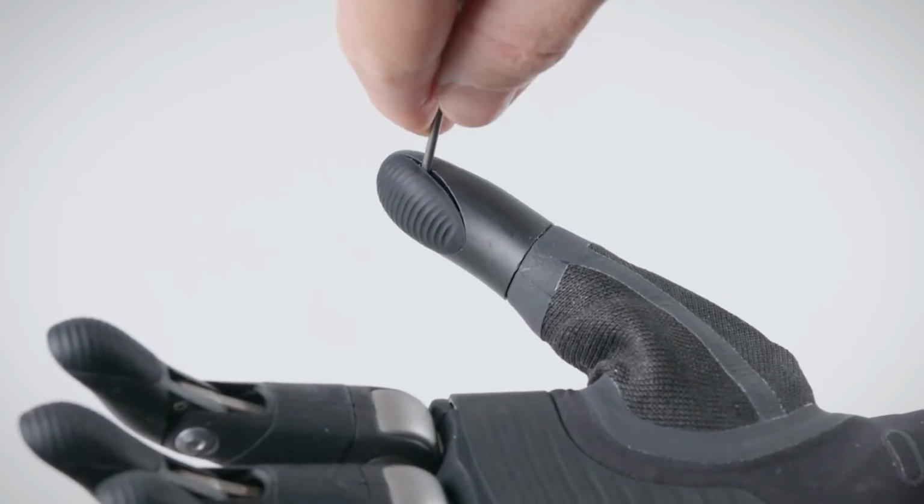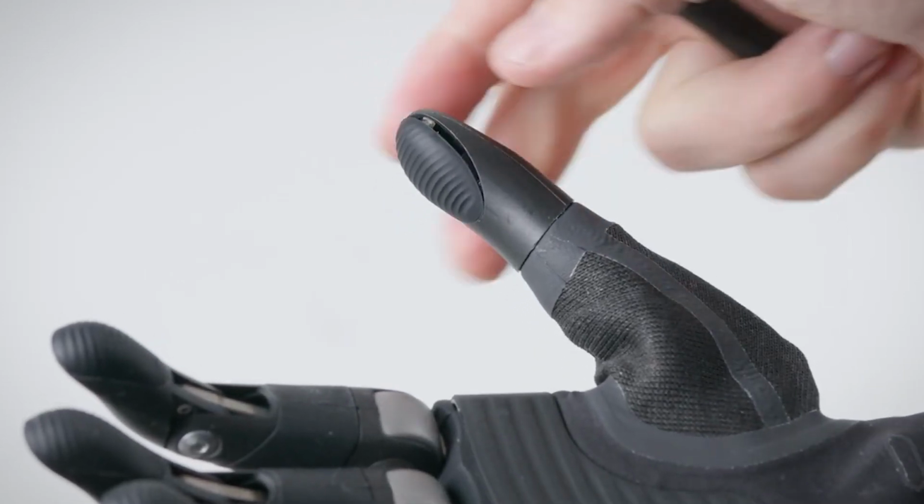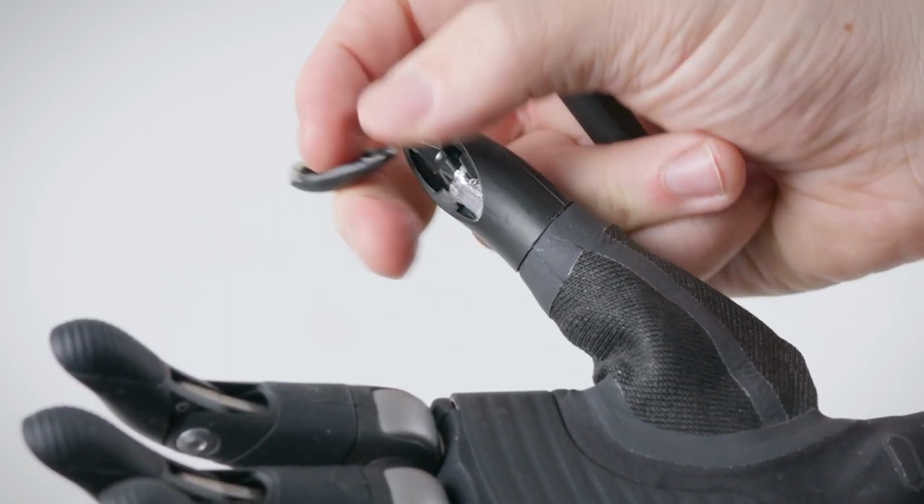To remove the grip tip from the thumb, place a screwdriver here between the plastic and the grip tip, apply a small amount of pressure and it should disconnect. You can now completely remove the grip tip.